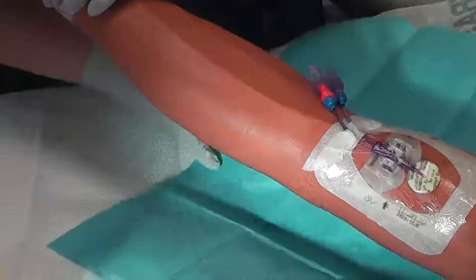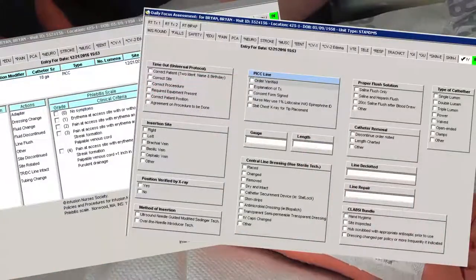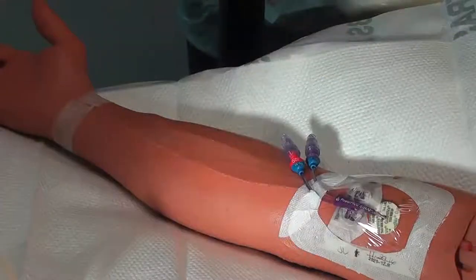Once the dressing change has been completed, document the change in the nursing assessment procedure section, including insertion site condition, external centimeters, and the patient's tolerance to the procedure.